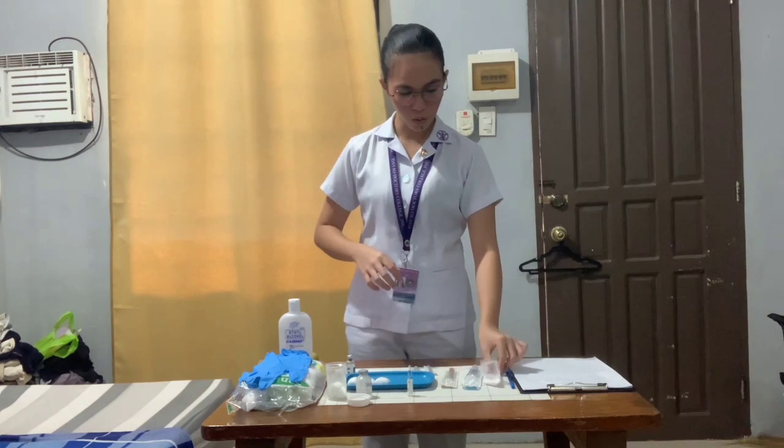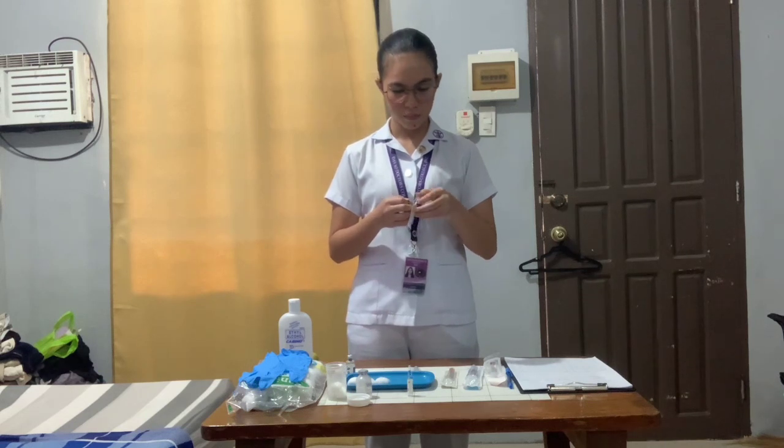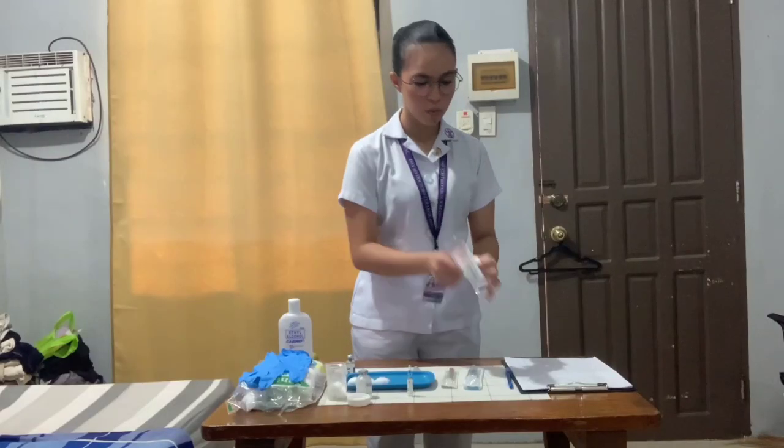And then we are also going to use our aspirating needle. So we are just going to grab the barrel. Okay, so now that our filter needle, or our aspirating needle, is ready, we are now going to proceed in withdrawing the medication.